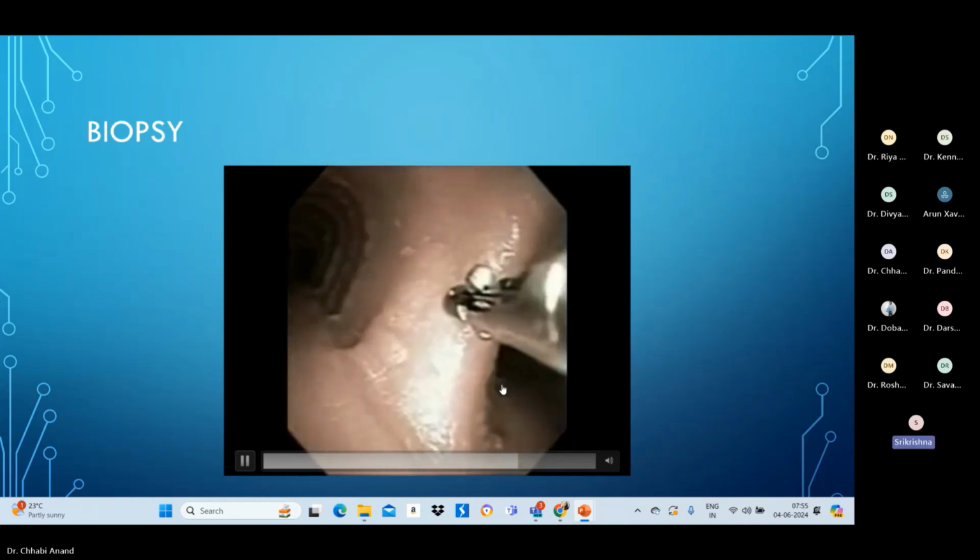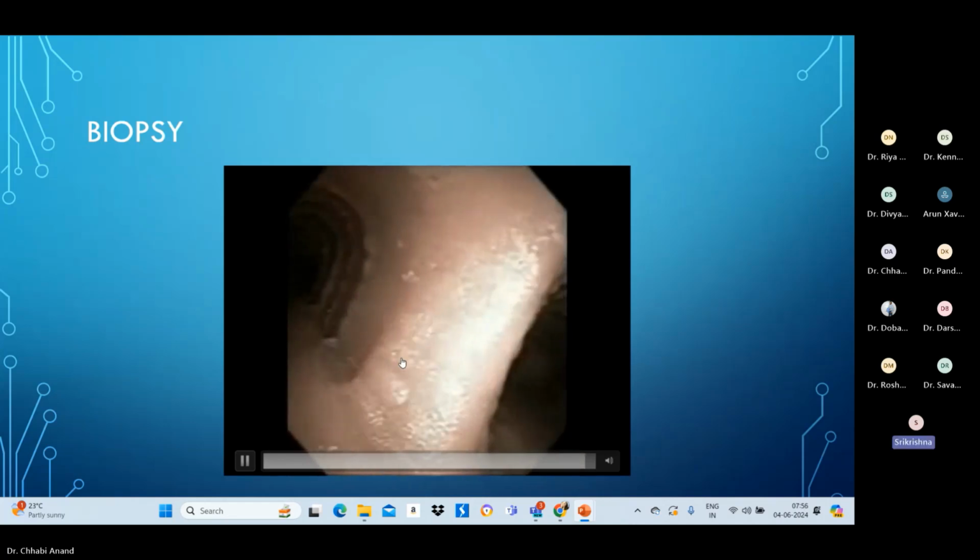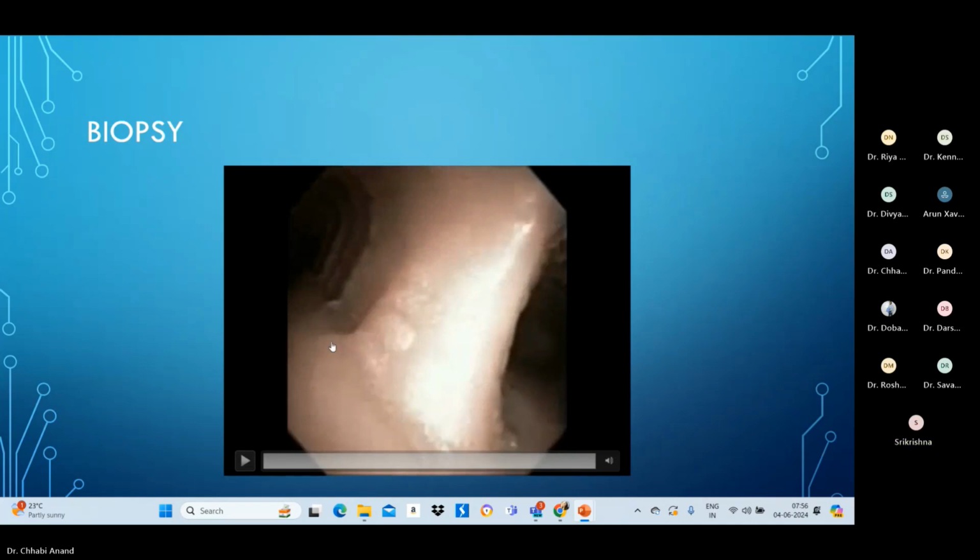One minute. How do you differentiate upper lobe versus lower lobe bronchial openings? As you pass the bronchoscope through, you will start seeing the division of the bronchi into different branches. If you keep following without knowing where you are, you may get lost. So you have to come back to the original point, the carina, then go on to the different major bronchi, and then subsegmental bronchi.